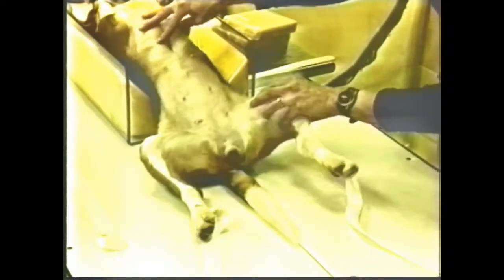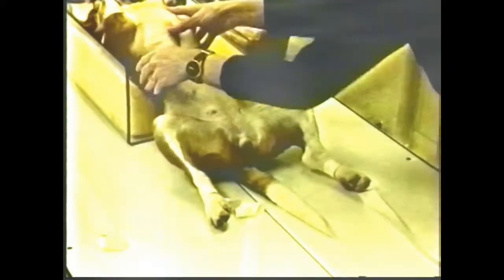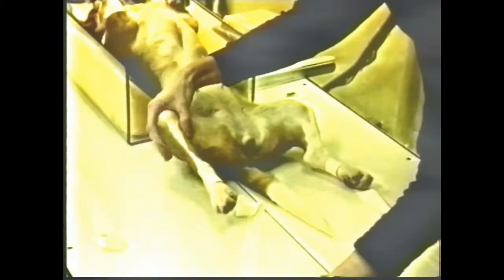Next will be the VD extended pelvis view. This position is tremendously facilitated by sedation and/or anesthesia. We will demonstrate the position of the animal without any manual restraint to reduce the radiation exposure to personnel. Notice that a V-trough is being used, which will control the abdomen and the thorax.